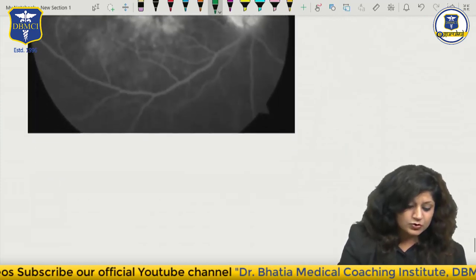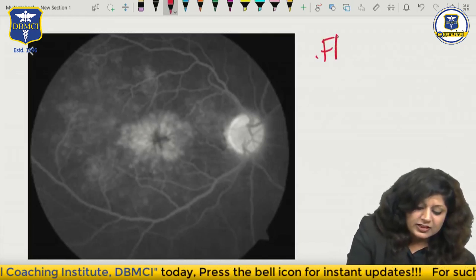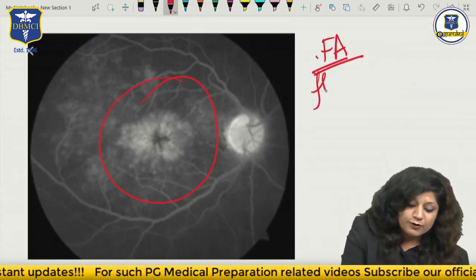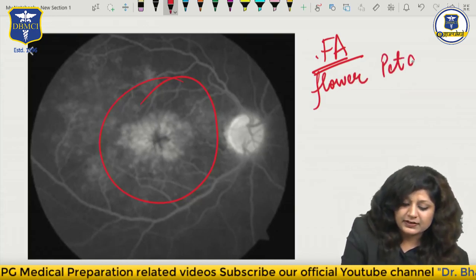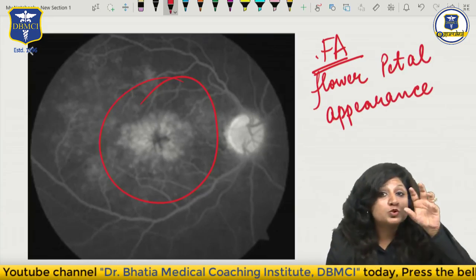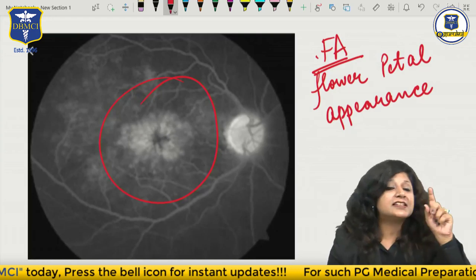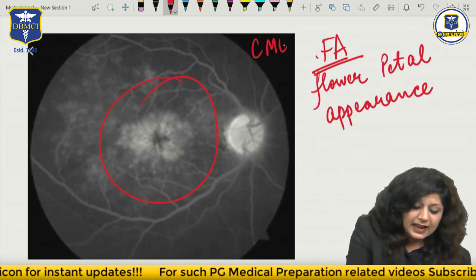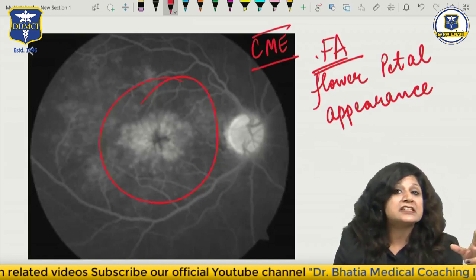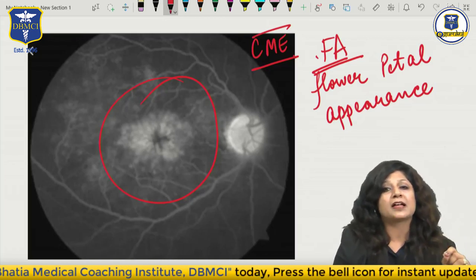Now try to concentrate on this one - this is another angiographic finding. This FFA is showing a petaloid pattern - there are so many petals here. This is called the flower petal appearance. From where are they coming? From so many cyst-like spaces, and cyst-like spaces were present in CME. Therefore this FFA finding is of CME. While you get the mushroom pattern in CSR, we get the flower petal appearance in CME - cystoid macular edema.